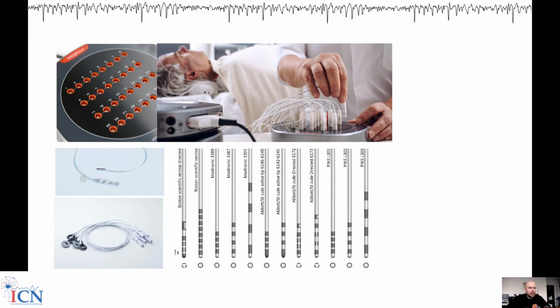One thing that we should add, especially as this is the more practically oriented workshop, is that whenever you have a higher impedance electrode, it is more difficult to get a good signal. The LFP that we are recording is extremely low in amplitude compared to EEG or cortical activity, and the higher impedance of the small contacts makes it even more difficult to capture.